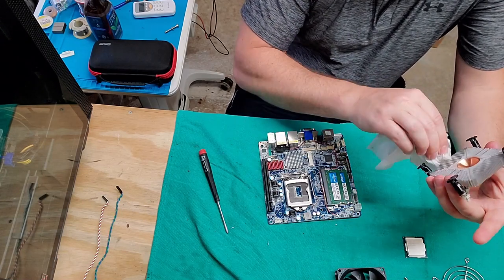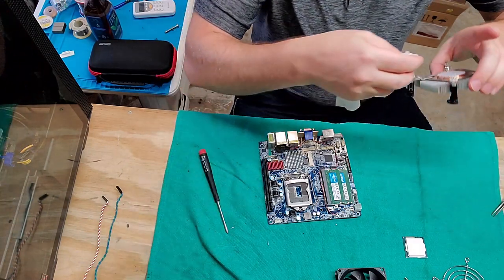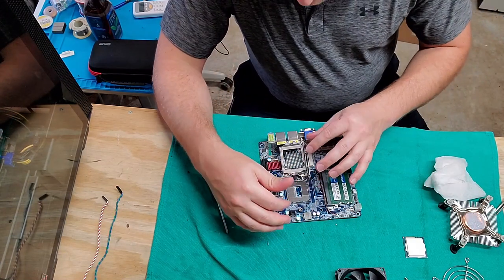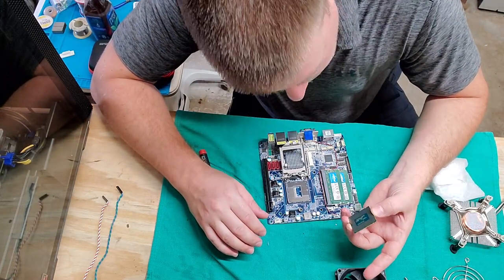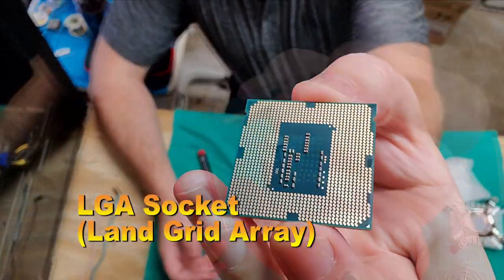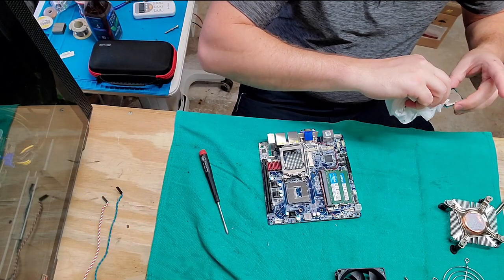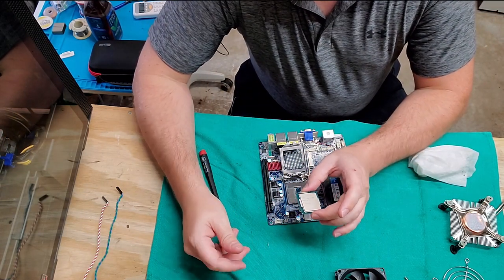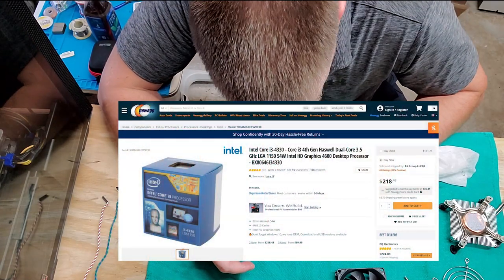I'm just cleaning off the fan right now, cleaning it up. Wow. I bet you this guy is going to work just fine. Load a fresh copy of Windows on it. All right, so I'm going to go ahead and put the CPU back in here because you don't want to leave it out. They will get damaged. You see all the pins are actually here on the socket instead of on the CPU, which is good because the CPU is less likely to get damaged than the socket, you would assume. And CPUs are way more expensive than a new motherboard. I mean, the higher end motherboards can be $700 or $800, but a higher end CPU can be thousands of dollars. So I'm not really sure how much this CPU costs, but I'll figure that out.